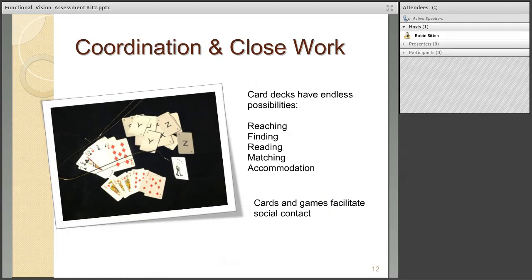I love card decks because you get 50 of something in a tiny little package. What you see here are two playing card decks, one large size and one mini. You could add the large print card decks as well, braille cards if they are of interest. Souvenir card decks like famous authors, paintings from the Louvre, etc. can be used for all kinds of purposes, from simple recognition to observing response to visual clutter to discriminating details. They take up very little space.